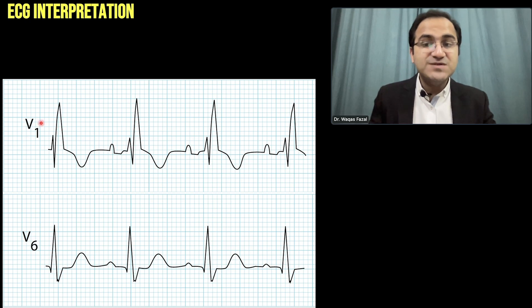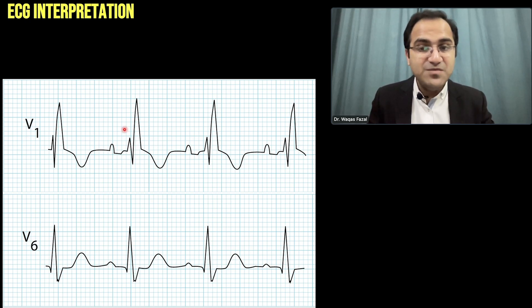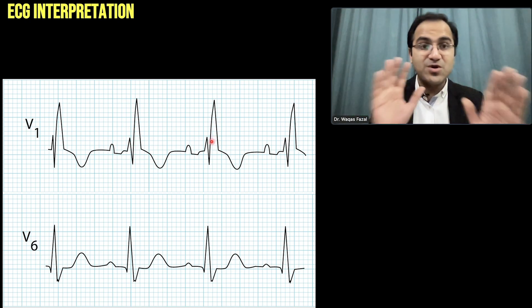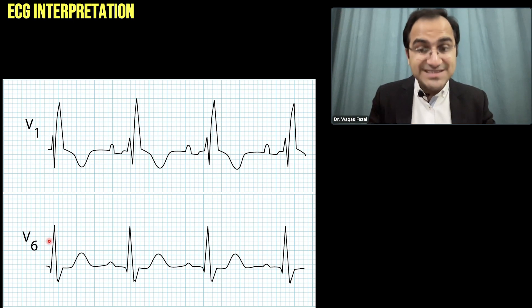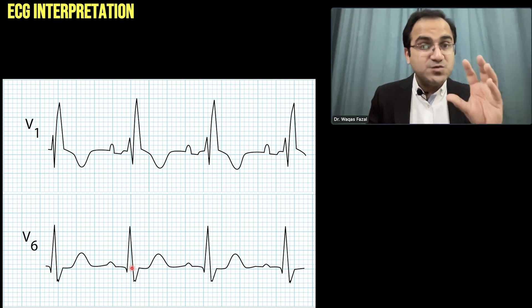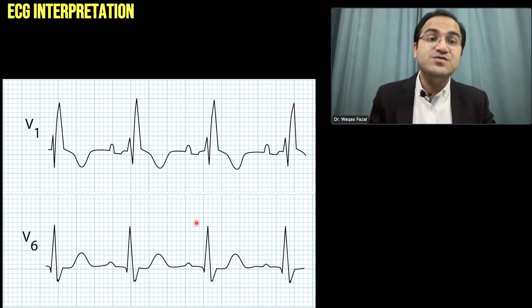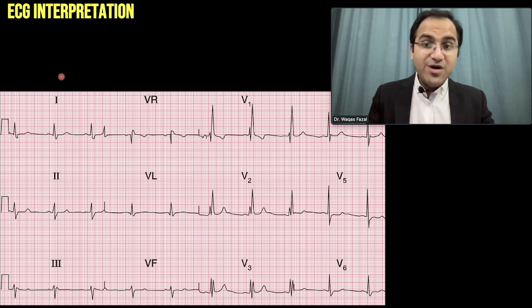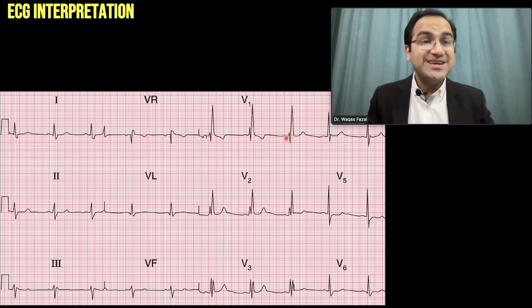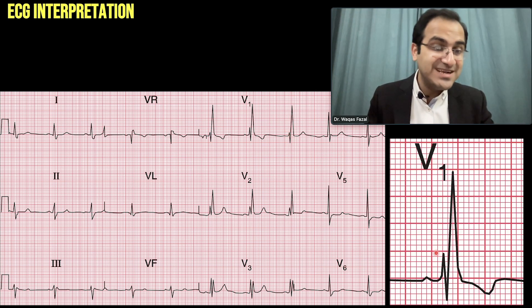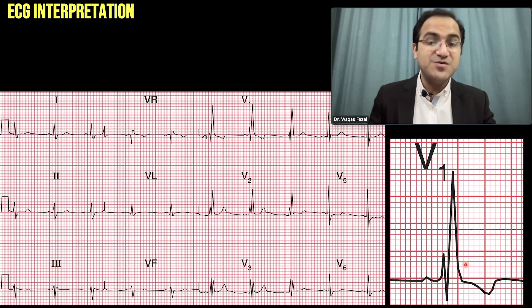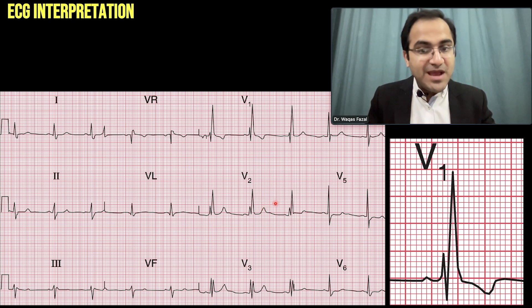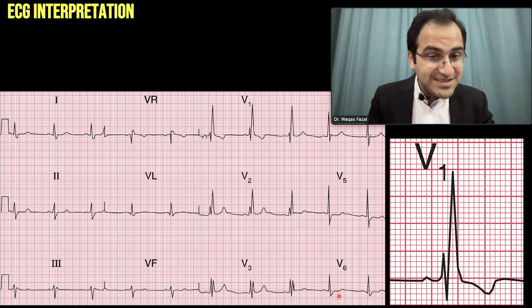In this ECG, if you look at V1 you can see the two QRS complexes — the M wave — due to separate depolarization of the left and right ventricle. In V6, you can see the deep, slurred S wave. Looking at another ECG, in V1 there are two QRS complexes forming the M wave, the rabbit ears, which you can also appreciate in V2 and V3. In V5 and V6, the slurring of the S wave is clearly visible.